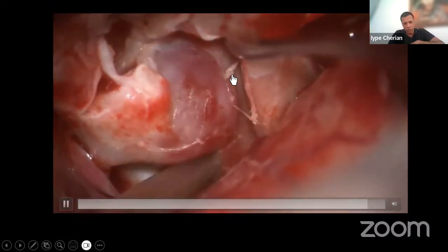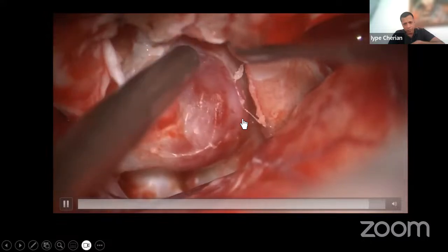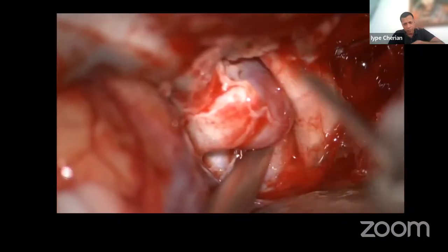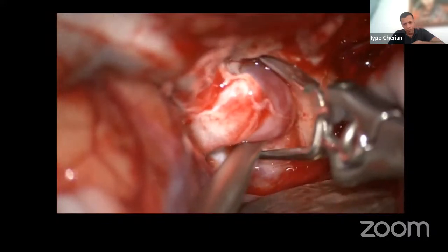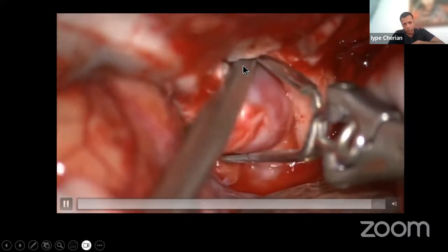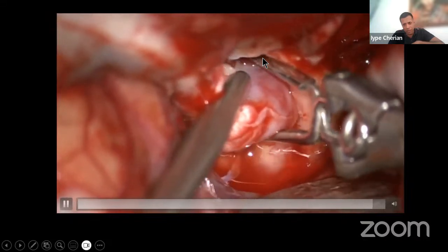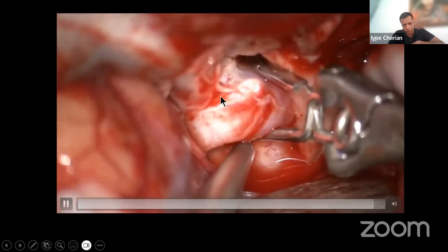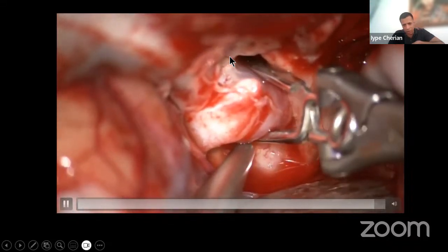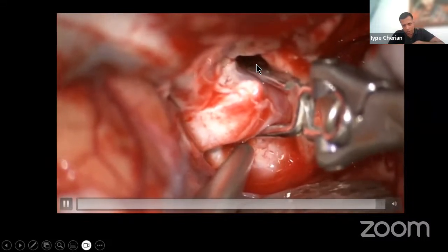And that is a carotid aneurysm line. And you put a straight clip. And when you put the straight clip, you can see the carotid. Medially, you can see the cavernous carotid. That is the C3 carotid, paraclinoid carotid. That's the proximal dural ring. The distal dural ring is cut here. That's the proximal dural ring cut, and we are going into the cavernous sinus with the clip.